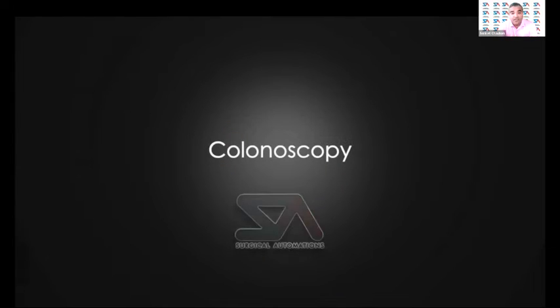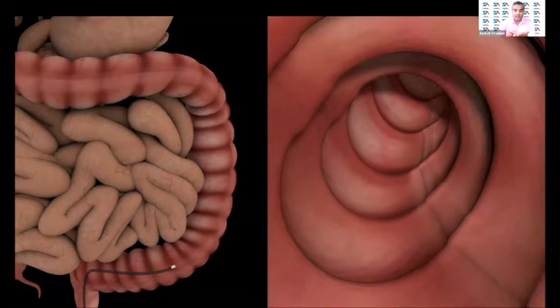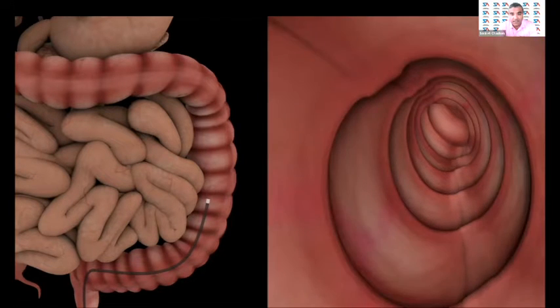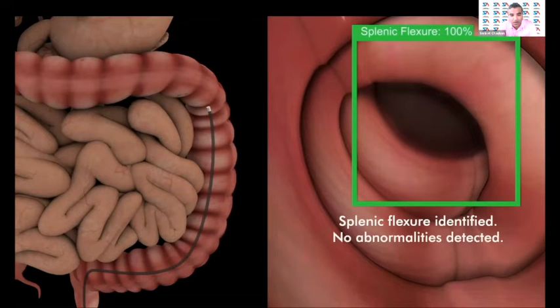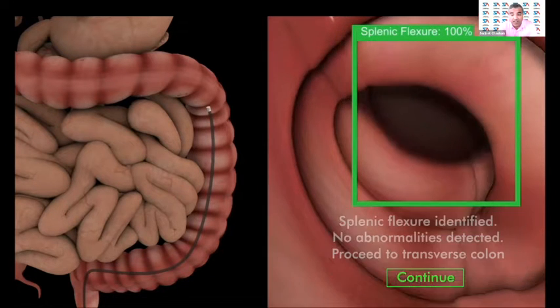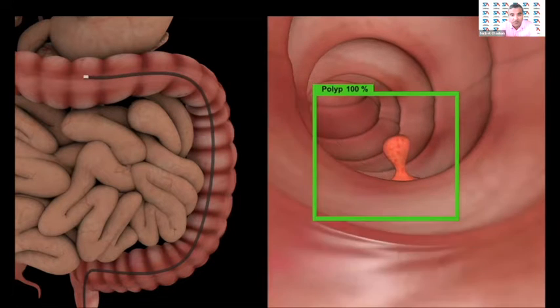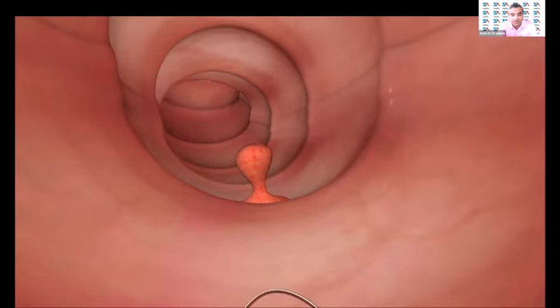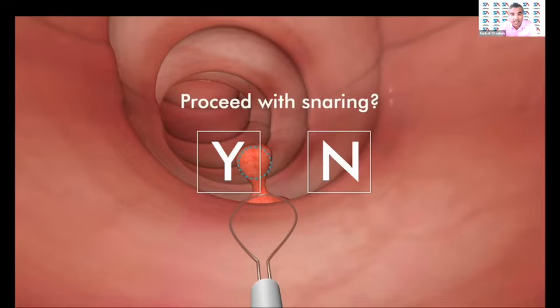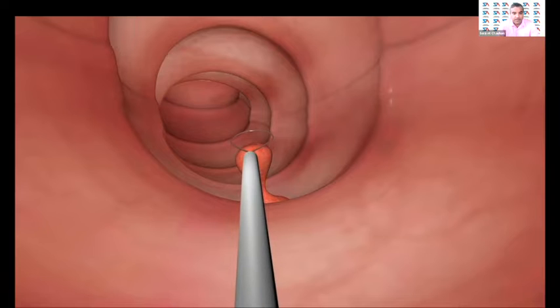And the user interface in here is a wireless tablet. So you're sitting on a chair with this wireless tablet. The only movement you're doing is swiping. So the case of colonoscopy looks for splenic flexure of the colon and other normal anatomical landmarks that we are as physician trained to do. In this case, it finds a polyp. And again, the robot recommends to take the polyp out. The snares are attached next to the robot. It advances automatically. It gives the trajectory of where it's going to take the bite. And once the physician okays it, it goes and takes that bite.